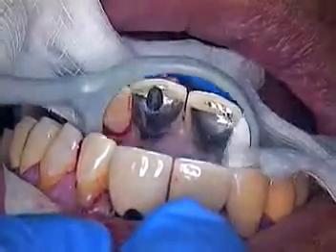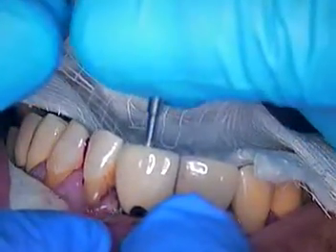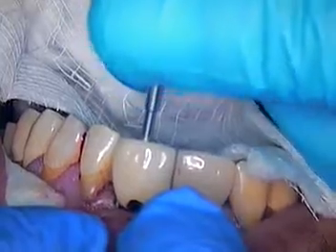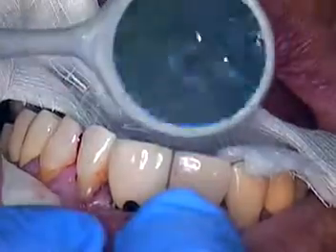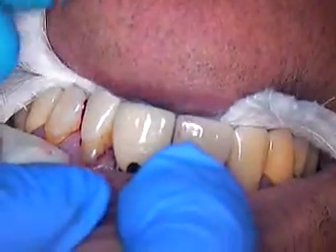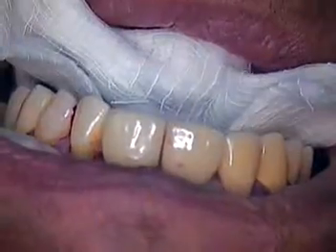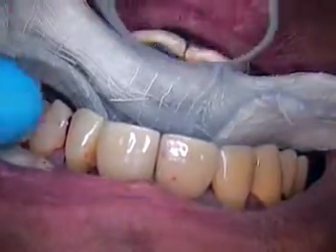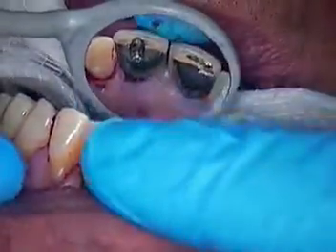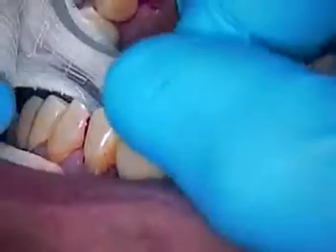There's just a slight little space in between his anteriors. And I've got to ask, Les, was there a slight space between your two front teeth? Very slight. Okay, so I'm going to show you that space so that you can see it. I just didn't know because it looks like everything is lining up properly.